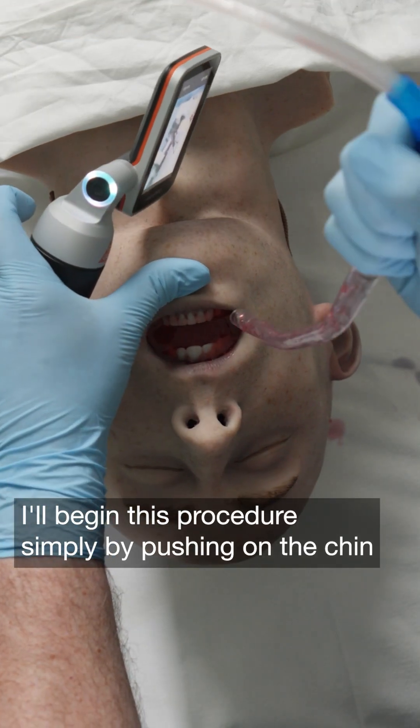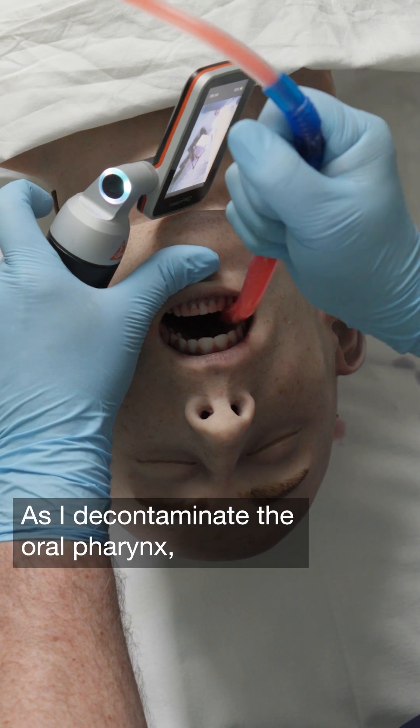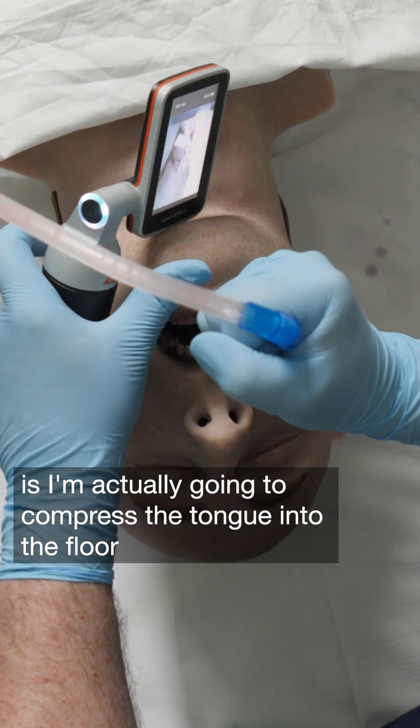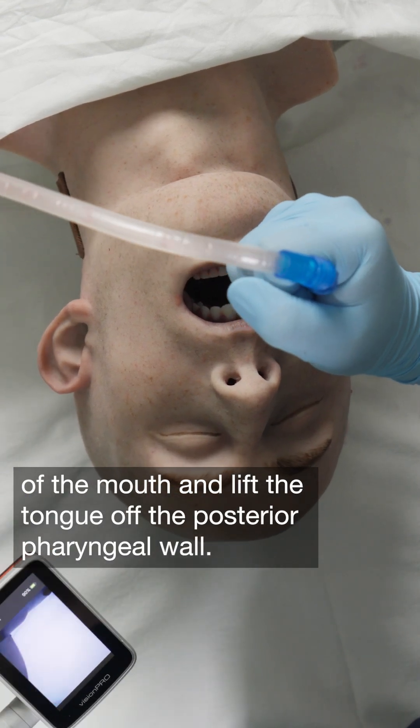I'll begin this procedure simply by pushing on the chin and inserting the suction into the oropharynx of the mannequin. As I decontaminate the oropharynx, what I'm going to do next is I'm actually going to compress the tongue into the floor of the mouth and lift the tongue off the posterior pharyngeal wall.